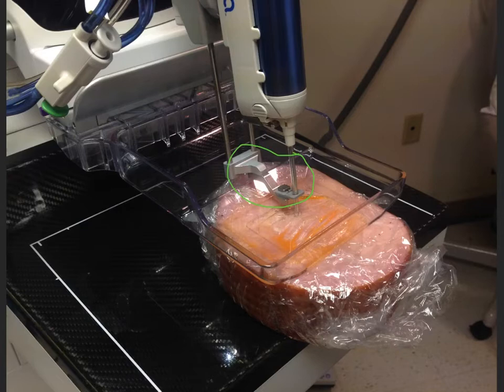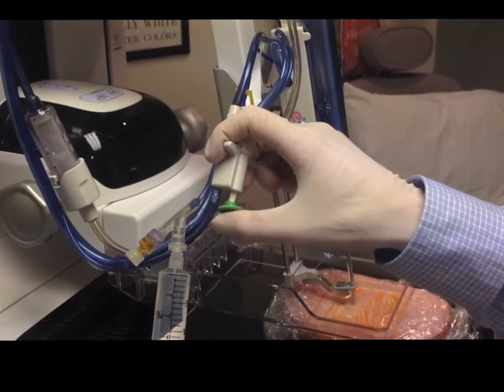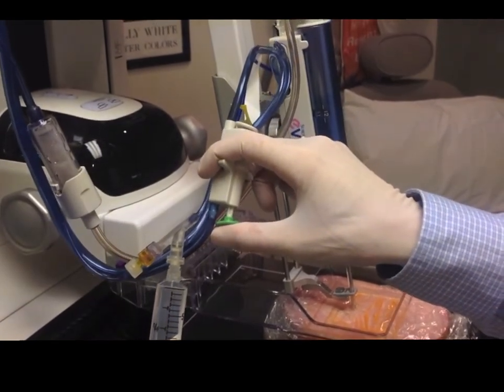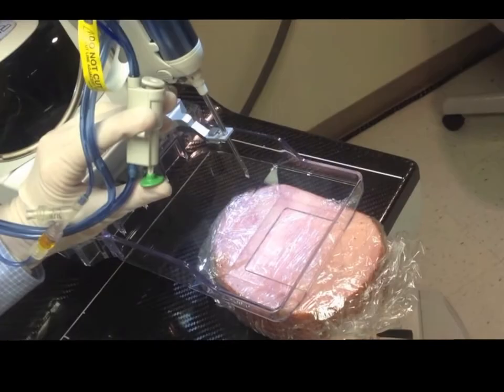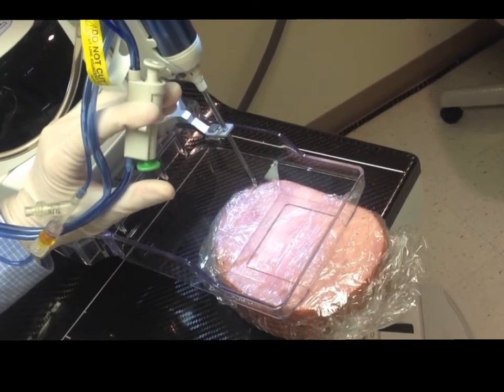Always make sure that your needle guard here is advanced close to but not directly touching the skin surface before you deploy the needle and before you do any biopsies. Before you deploy the needle, tell the patient they'll hear a noise like a champagne cork. All right, you're going to hear a poppy noise at the count of three. One, two, three. Good. Out of the patient goes forward two centimeters of regular needle or 12 millimeters for the petite.